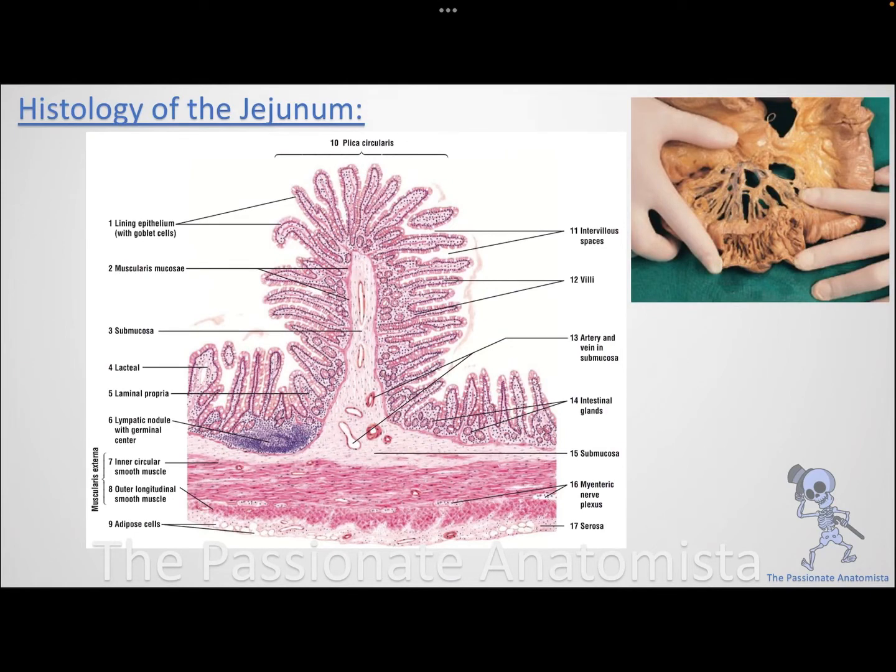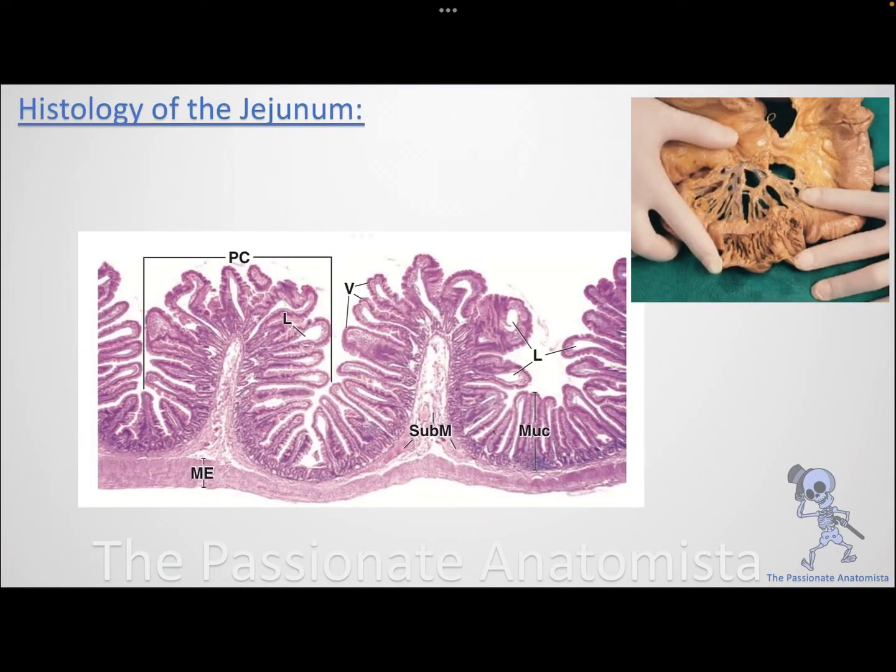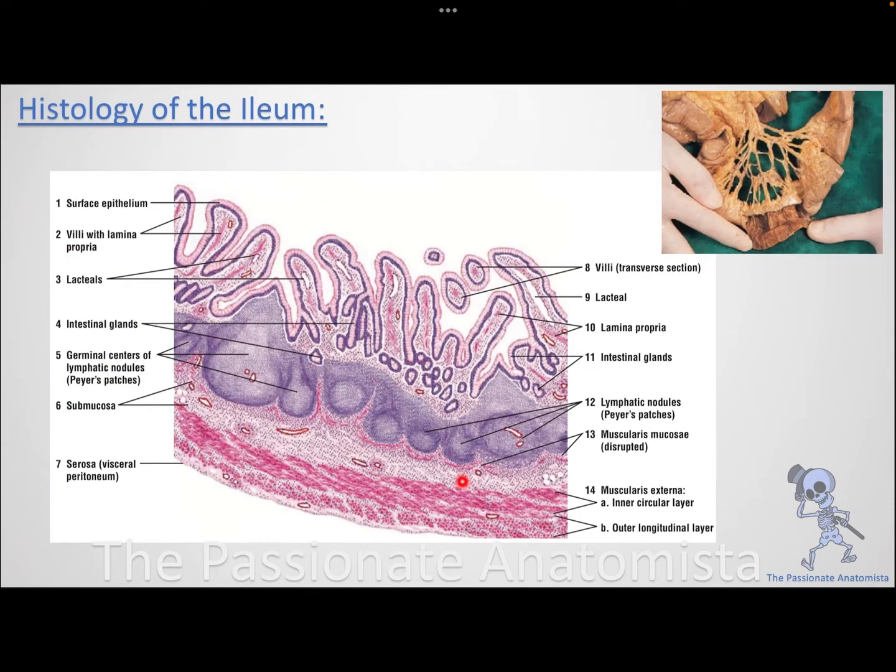Now, I'm not going to repeat everything because the general idea is the same. I just want to tell you, if you guys look at your submucosa, it does not have glands. So this is not duodenum. This is jejunum. But why it's not ileum? Because in ileum, we have, this is another one for the jejunum. In the ileum, we have lymphatic nodules. We have a lot of lymphatic nodules. This is what we call the Peyer's patches. We say it Peyer's patches, but we write it with an E, not A.